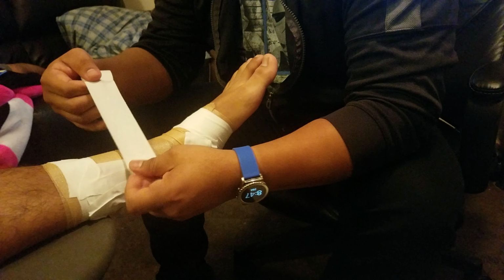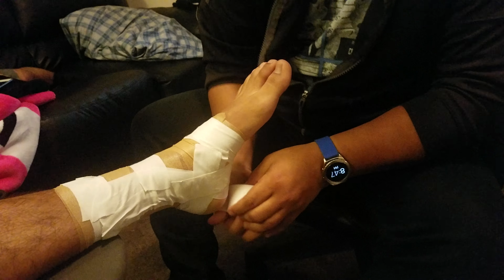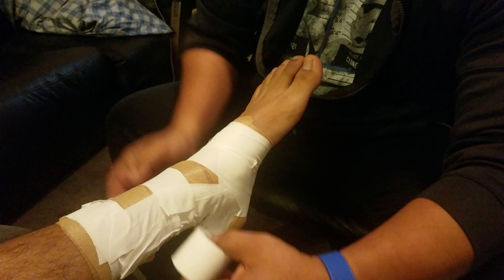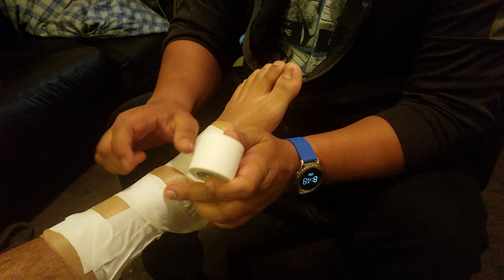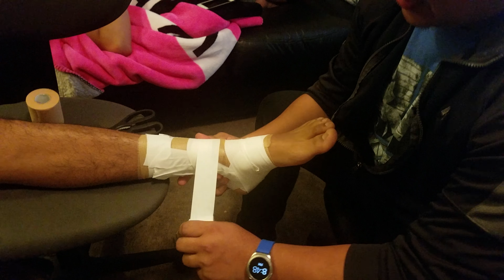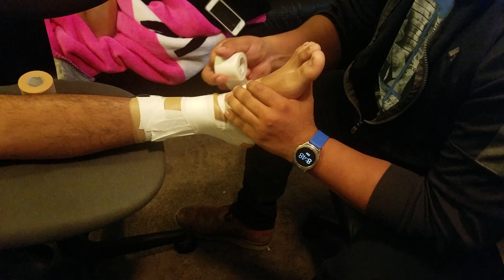anterior, come all the way down, right behind that ankle, right below the joint of the ankle. Just like so. We're going to do that one more time, because we're going from anterior to medial to lateral. Now we're going from lateral to medial. So the same thing, but a little bit lower. So this is just to help prevent injury, like I said, from the medial posterior line. So keep it dorsiflexed.